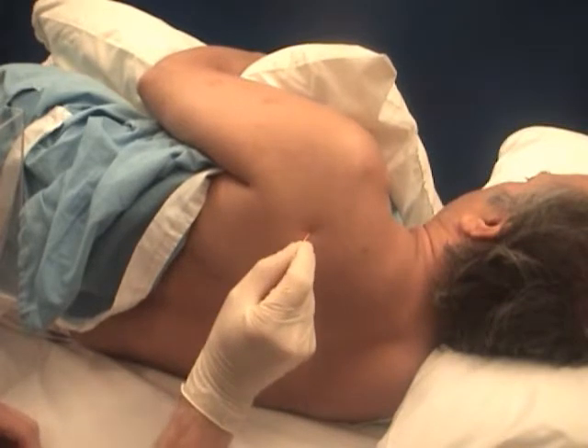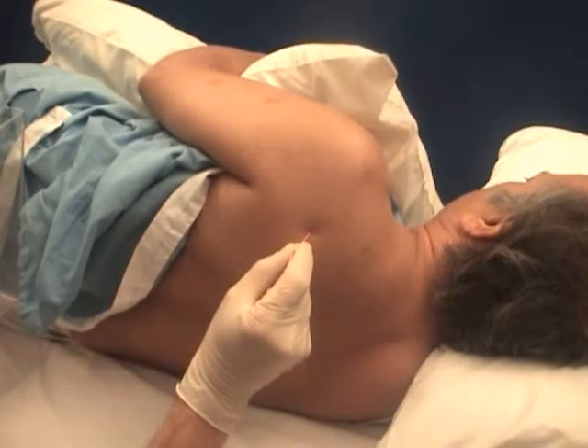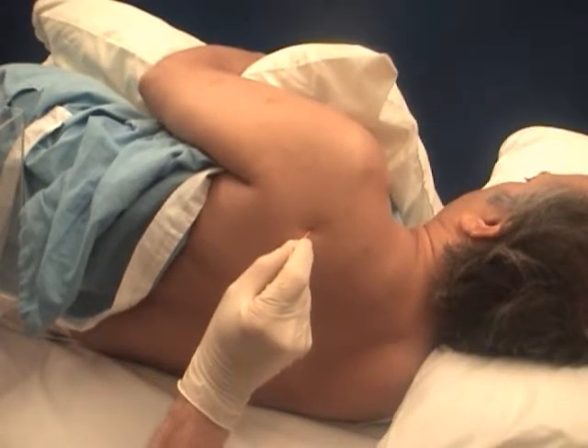The infraspinatus is deep to the trapezius. Therefore, the electrode tip should be advanced to the surface of the scapula very gently and then slightly withdrawn before recording. Activation is made by slightly externally rotating the shoulder.